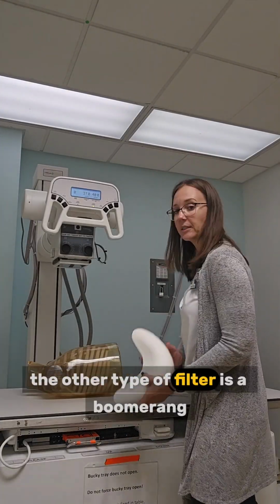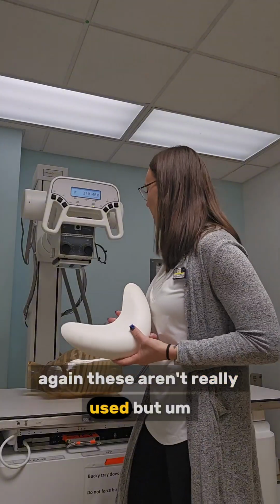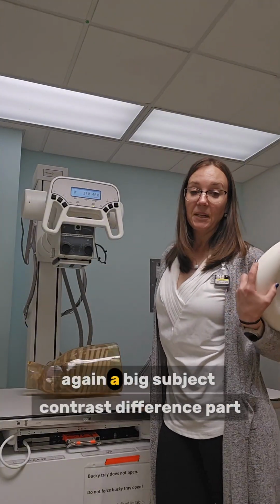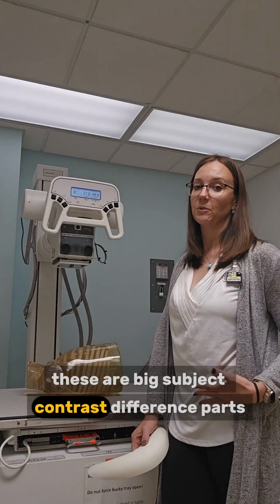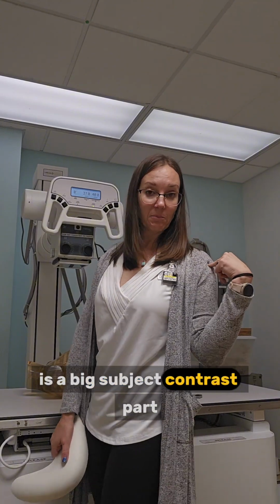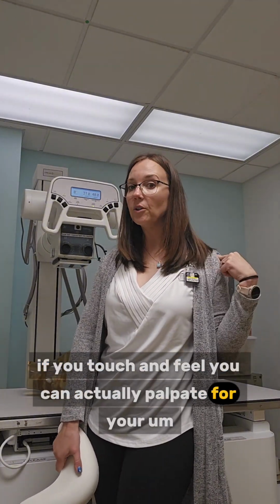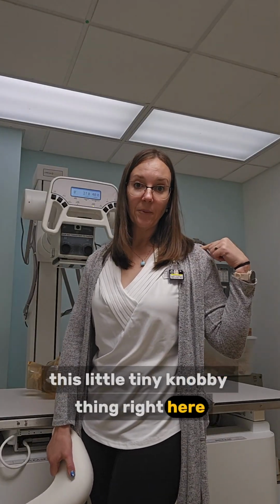The other type of filter is a boomerang, right? Boomerangs, again, aren't really used, but a lot of times you would use a boomerang for a big subject contrast difference part. The shoulder, for example, is a big subject contrast part. If you touch and feel, you can actually palpate for your AC joint, your acromioclavicular joint. It's this little tiny knobby thing right here.